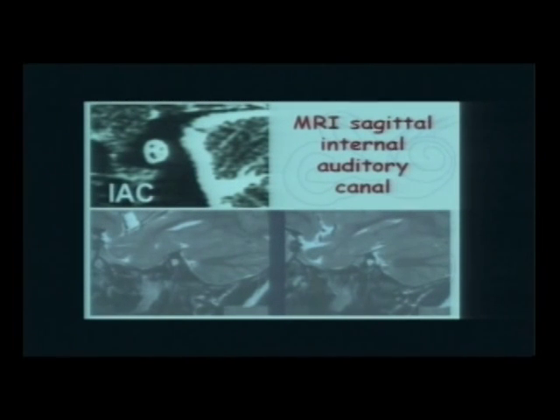inferior vestibular nerve. You see this patient here? This is a patient who has the four nerves there, and the same patient who has two nerves, one of them sticking to the anterior wall. No, it's different. It's different inside the canal.